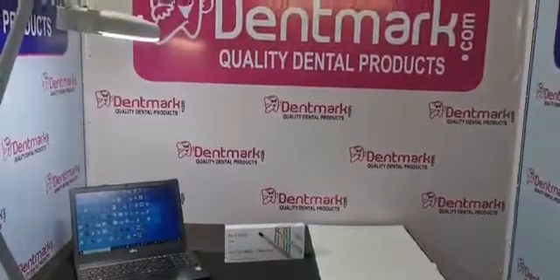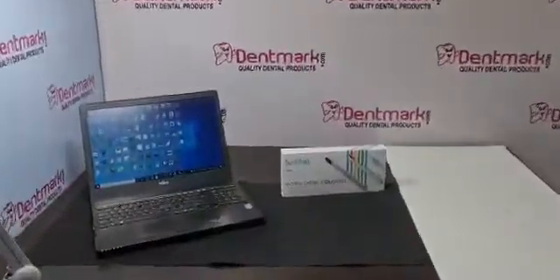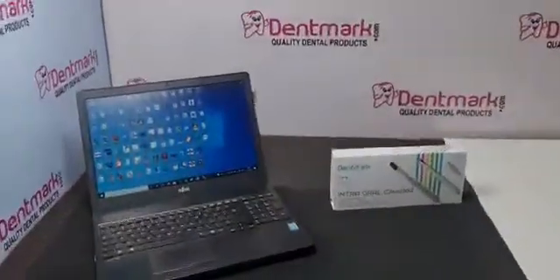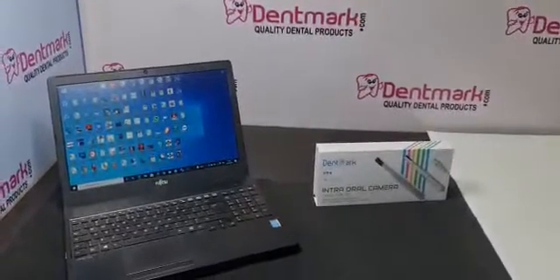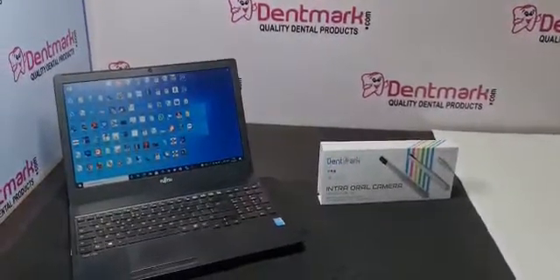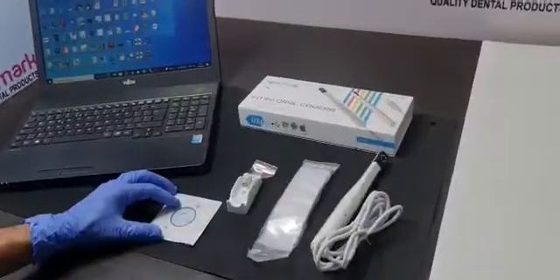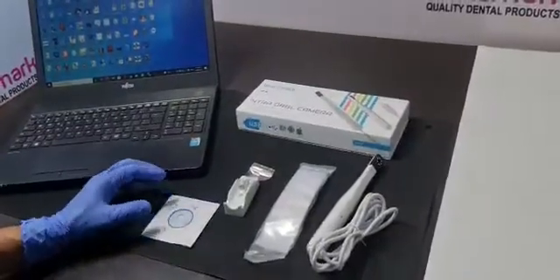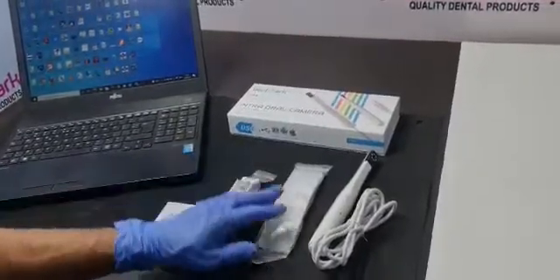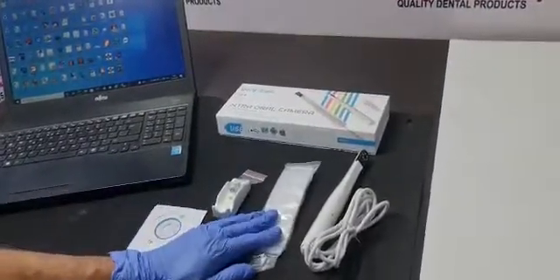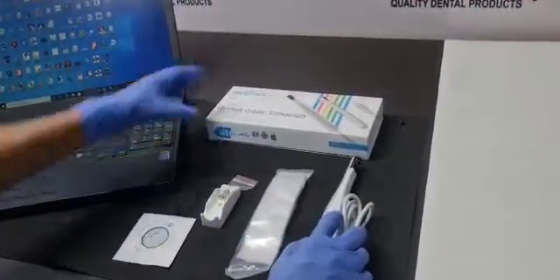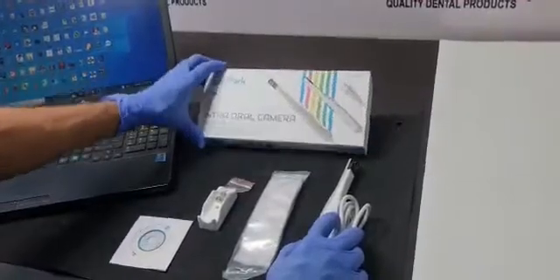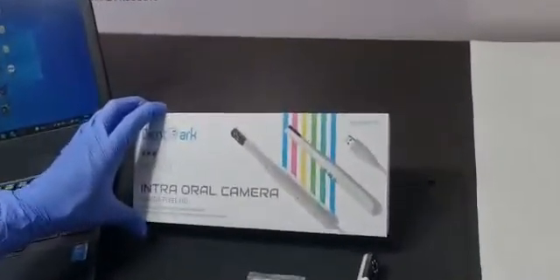Dentmark is going to show you the intra oral camera, USB intra camera 5 megapixel and the model is DM2060. So it comes with software CD, camera stand, sleeves and camera. So this is 5 megapixel HD camera.